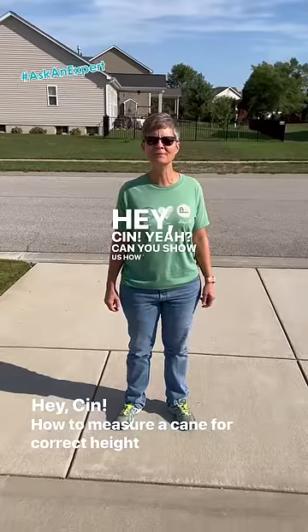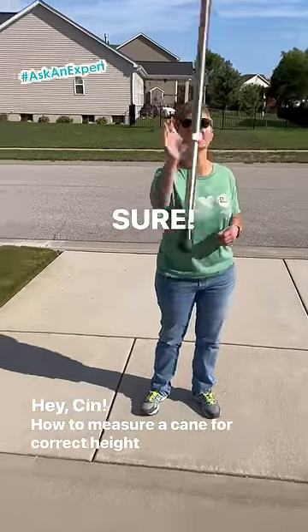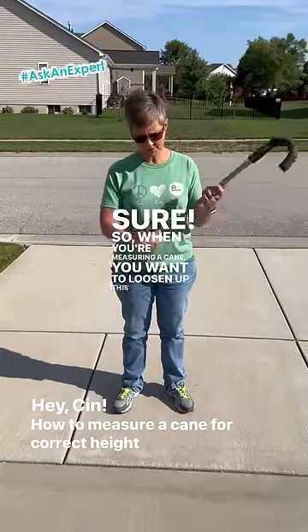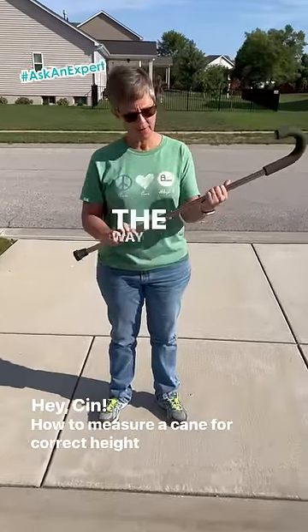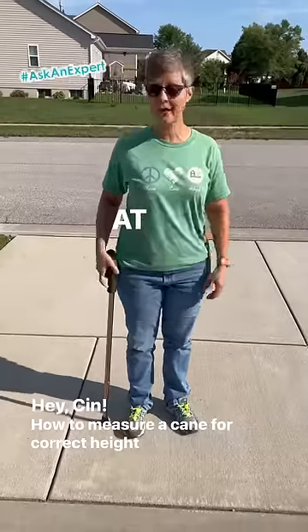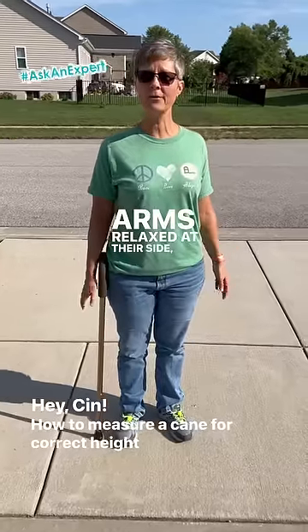Cyn, can you show us how to measure a cane for a person's height? Sure. So when you're measuring a cane, you want to loosen up this coupling down here. The way you measure is you're going to want the cane to hit the individual at wrist height when they're standing up nice and tall with their arms relaxed at their side.